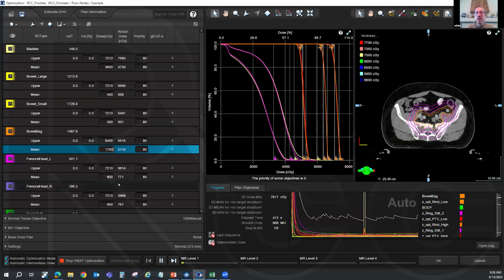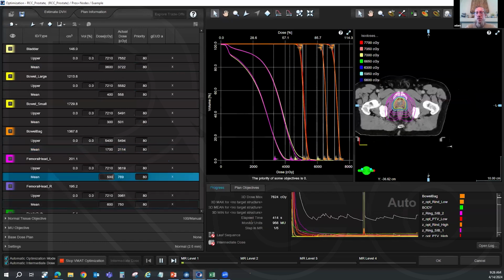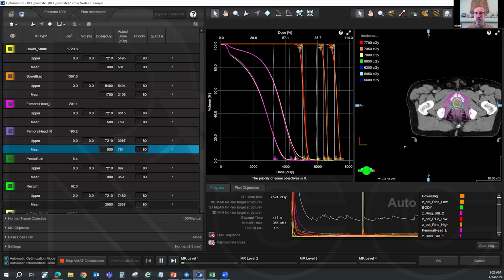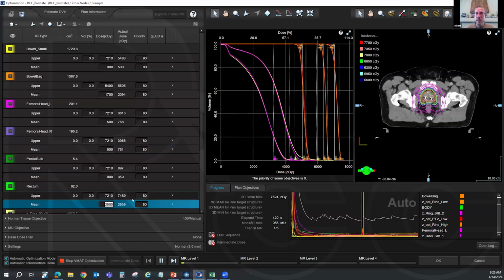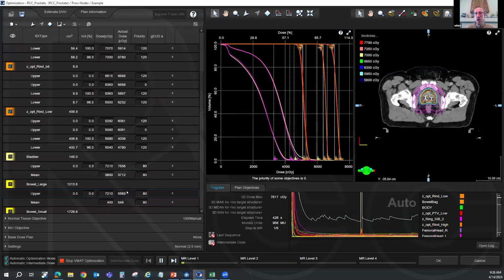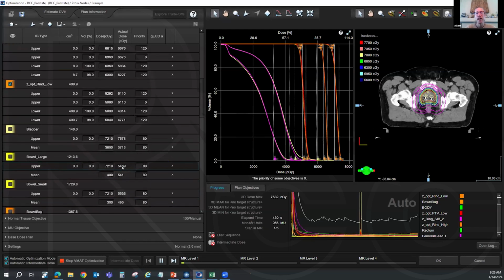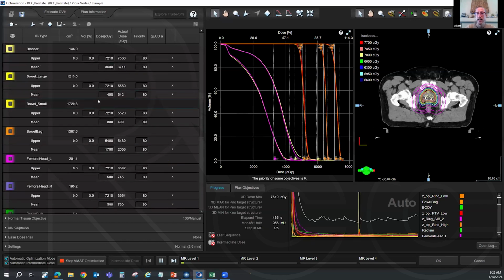And step 3, you can just barely fine tune some of the max organs at risk and some of the shoulders of the PTV. But you can see now, even all the ZPTVs, he has really good max doses right around 105%. His shoulders are close to full coverage. Again, he can perfect that slightly in step 3. And if he does the same concept of just pushing mean dose, making sure that it's about 150 centigray lower than the actual when it levels out, then by the time he's done, he'll have a perfect plan on first try.